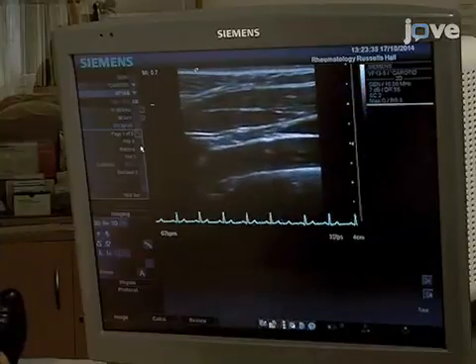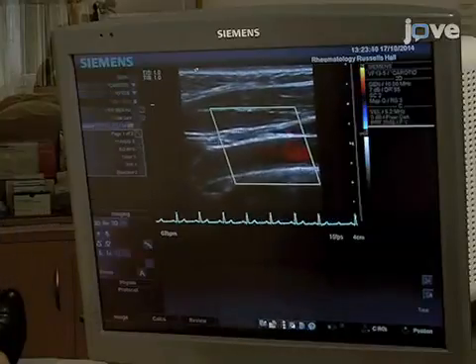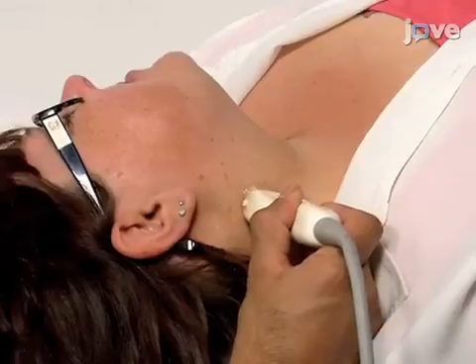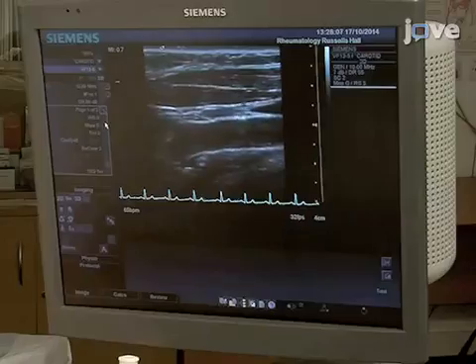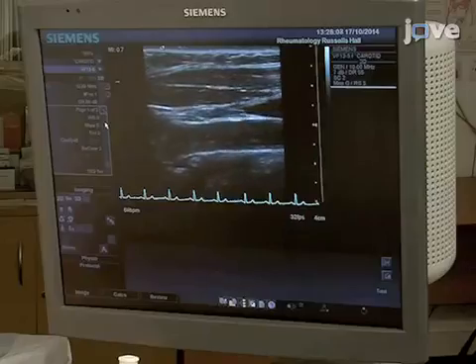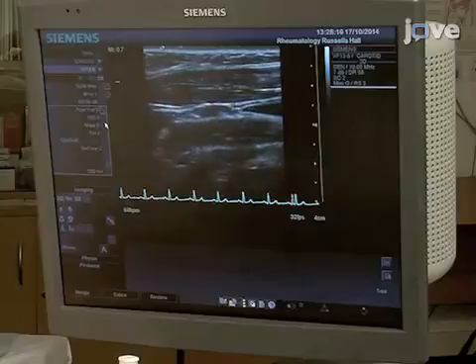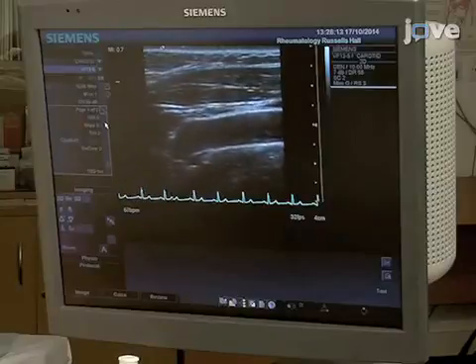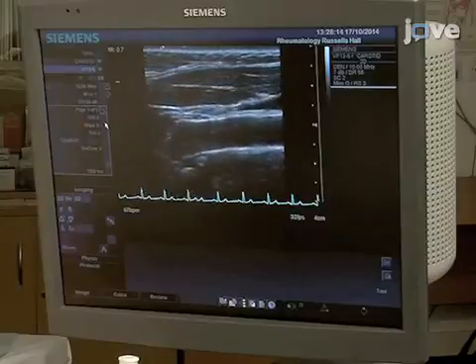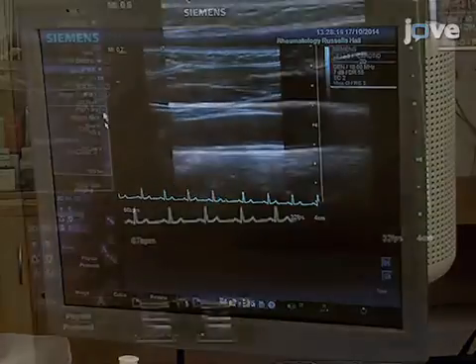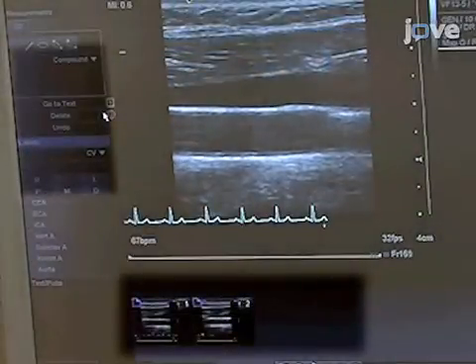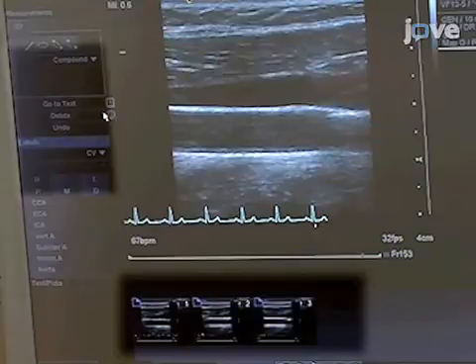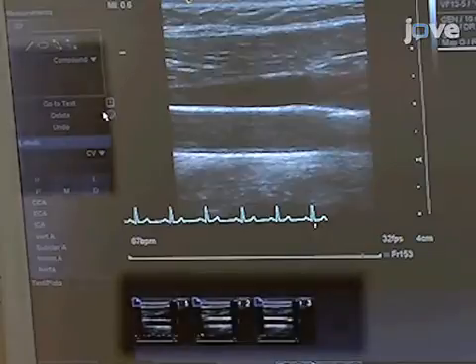The bifurcation shows the common carotid artery bifurcating into the internal and external carotid arteries. Scan the carotid artery along all its sections. In a longitudinal plane, identify the common, internal, and external artery. If any plaque is seen, save the images. Now take at least three images of a section that is free of plaque and is about a centimeter from the carotid bulb.